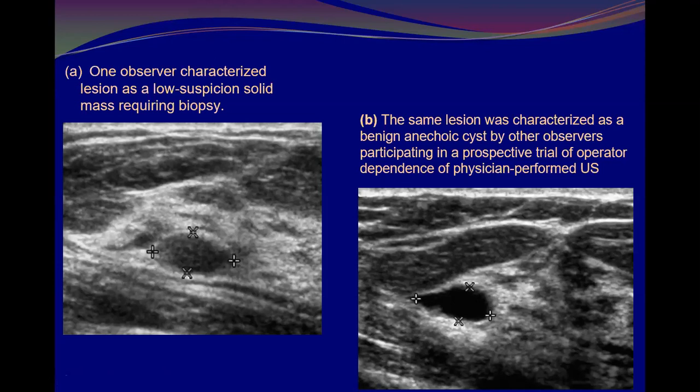Regarding what? Regarding the focus of the image, or grayscale. We are talking here, we have two main points. For me, I think both of them. Focal zone, and we have the TGC.